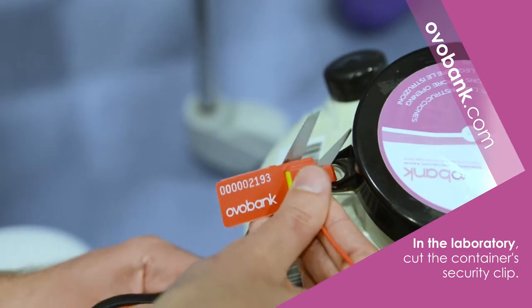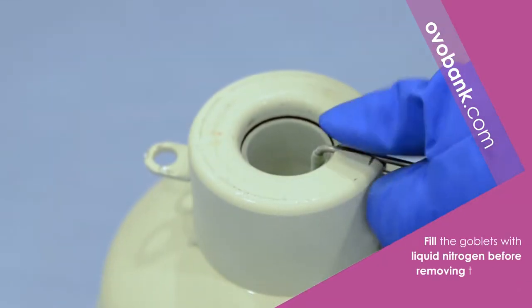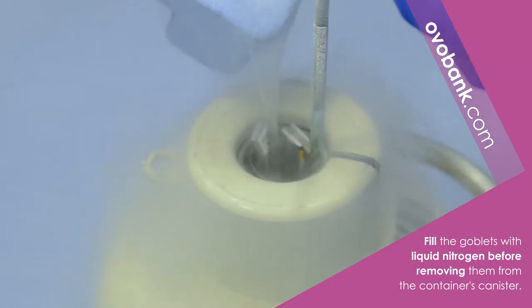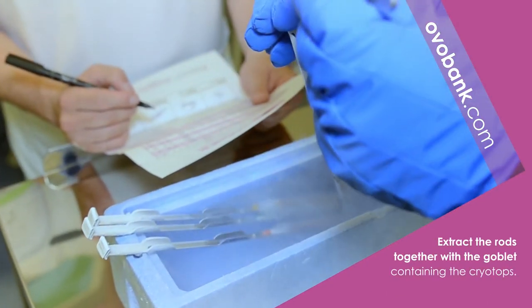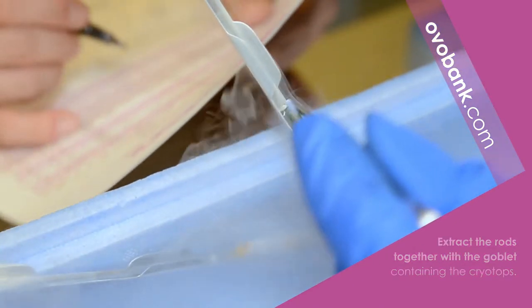cut the container clip and open the dry shipper. Fill the goblets with liquid nitrogen without removing them from the canister. Make sure the cryotops are always in contact with liquid nitrogen. The goblets code should match the one in the report.